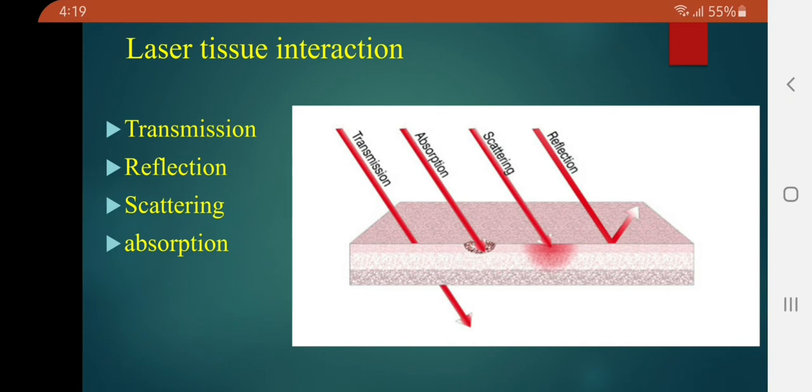Laser tissue interaction. Absorption. The tissues absorb the laser beam according to their characteristics, such as pigmentation and water content, laser wavelength, and emission. Chromophores are the compounds within the tissues which absorb the wavelength of light. The absorption is dependent on the amount of chromophores within the tissue. Dental tissues have different amounts of water content by weight, ranking from lowest to highest: enamel, dentine, bone, calculus, caries, and soft tissues. In general, the shorter wavelengths are readily absorbed in pigmented tissue and blood elements.